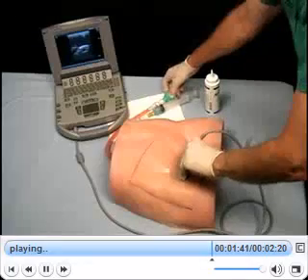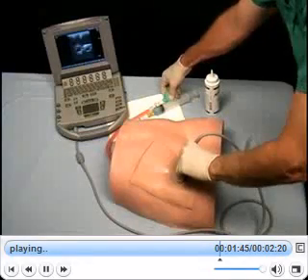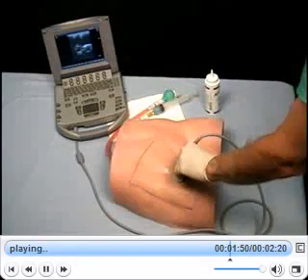By using the arterial pump, you can create a pulse and easily identify the artery by squeezing the bulb a quarter to half way and continue pumping the bulb in and out.